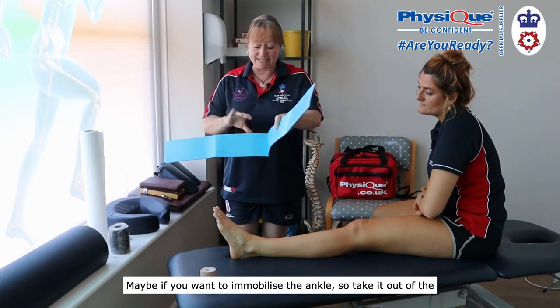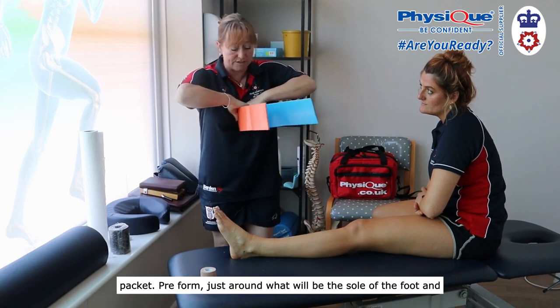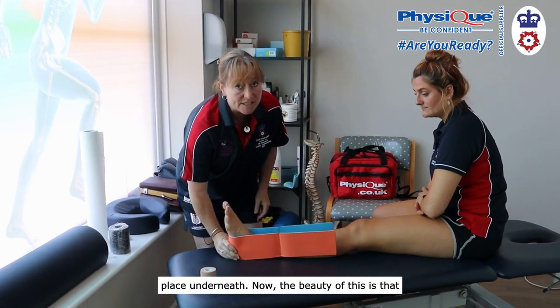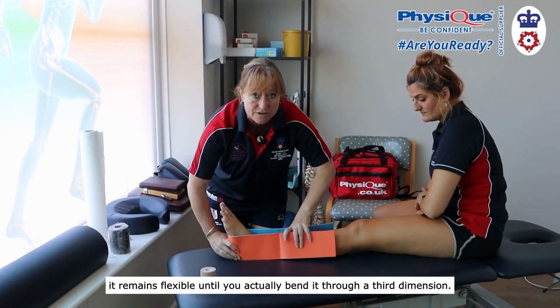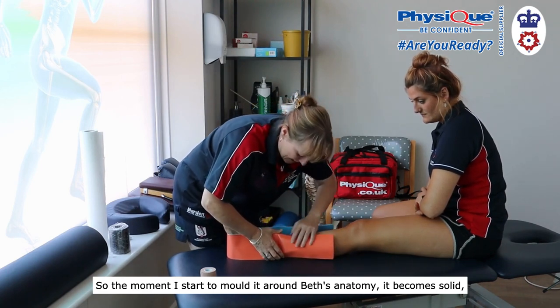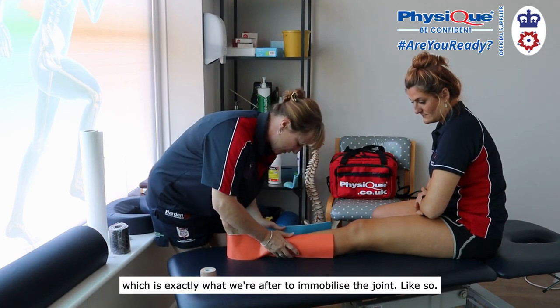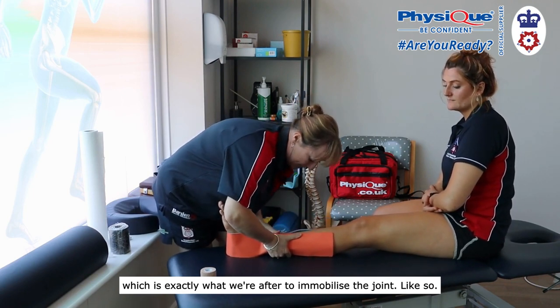Take it out of the packet, preform it around what will be the sole of the foot, and place it underneath. The beauty of this is that it remains flexible until you actually bend it through a third dimension. So the moment I start to mold it around Beth's anatomy, it becomes solid — which is exactly what we're after to immobilize the joint.